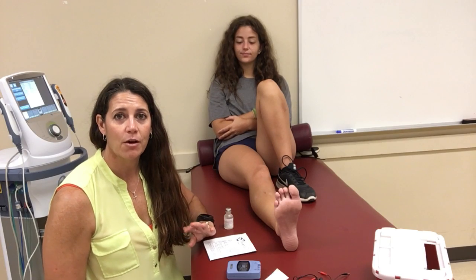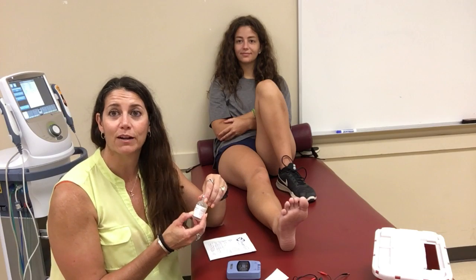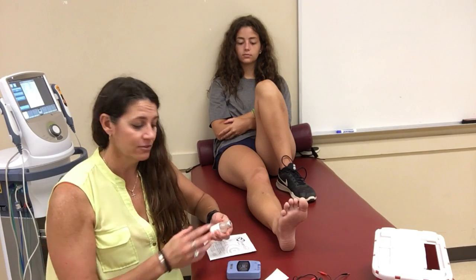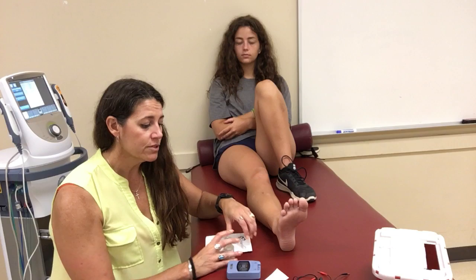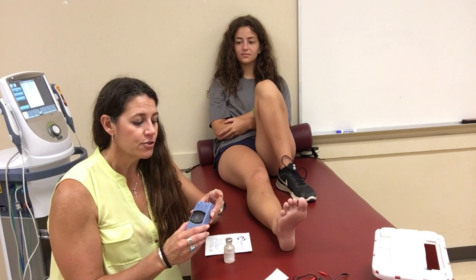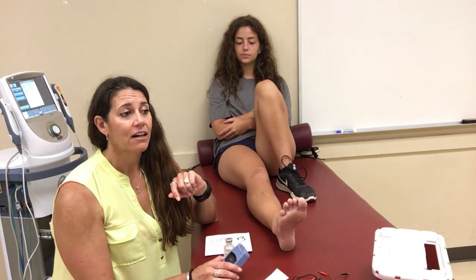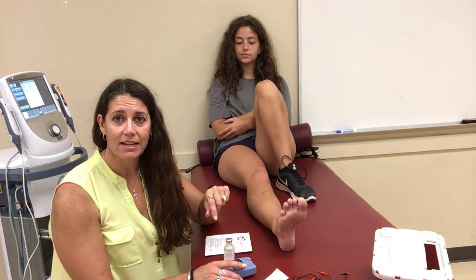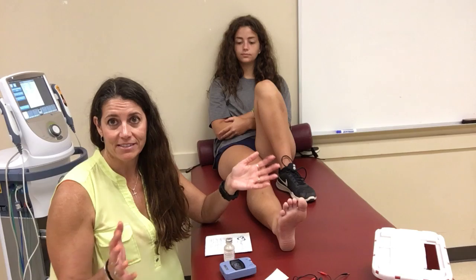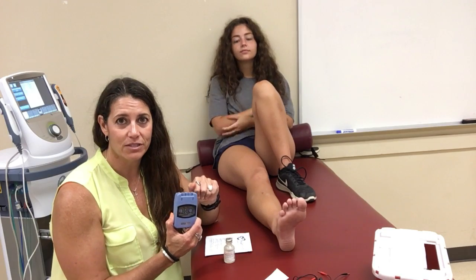We're going to be talking about iontophoresis, which deals with drugs — polarized drugs. Think 'ion': we're driving ions into the person's body using electricity. We're using a TENS unit here; we don't have an iontophoresis unit in the lab, so we're going to pretend this is one. Those units are very simple — they have a time adjustment, an intensity adjustment, and a power button. For purposes of this class, we'll use the TENS unit as our example.